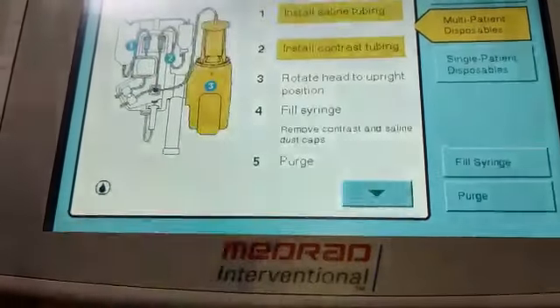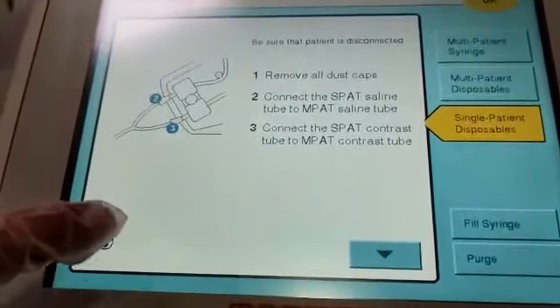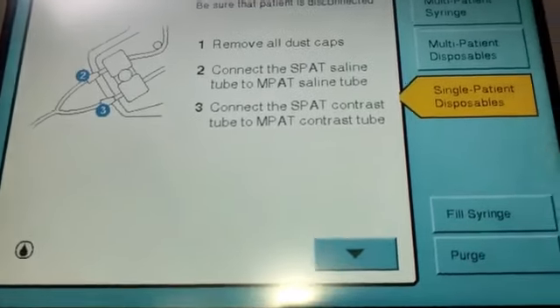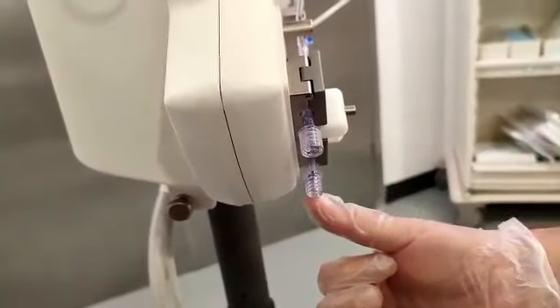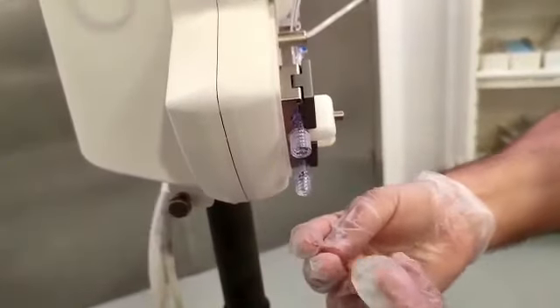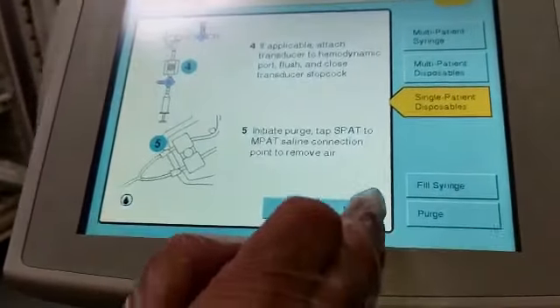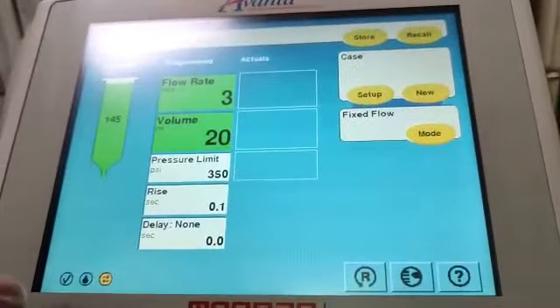After purging, press Complete to get it ready. Next is the single-patient tubing. Follow the instruction: remove all the dust caps and connect the saline tubing to its port. There are two tubings — one for saline and one for contrast — each with their respective ports. The next screen shows safety precautions for what to do after you complete the setup. We already filled the syringe and did the purge, so press OK.